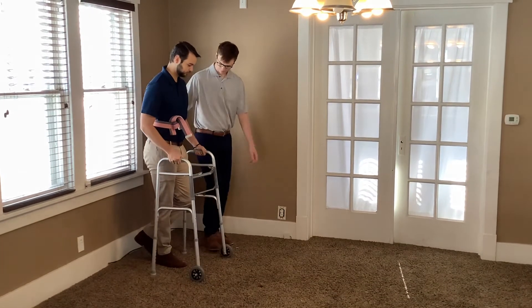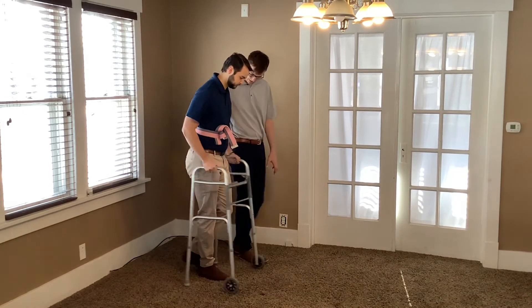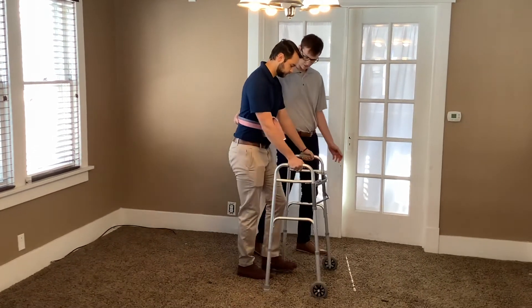Okay, so are you ready? Okay, walker forward, push those hands, bring that left leg forward — good — walker push. Well done.